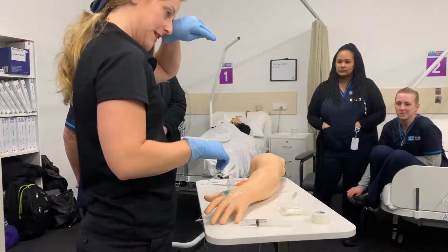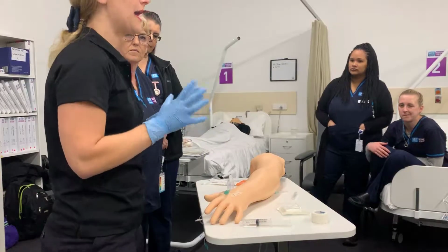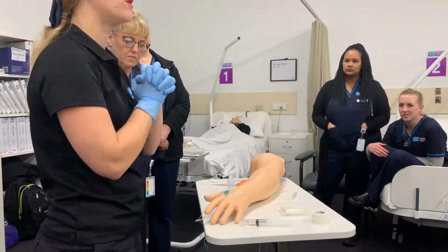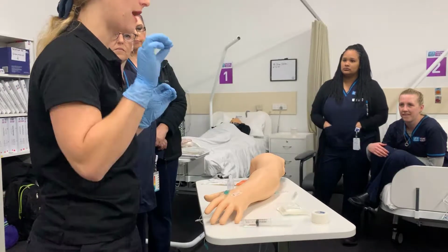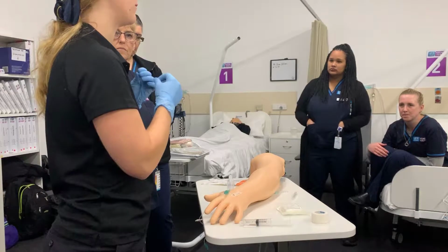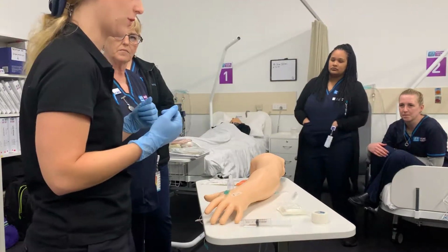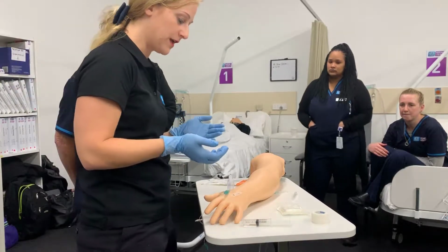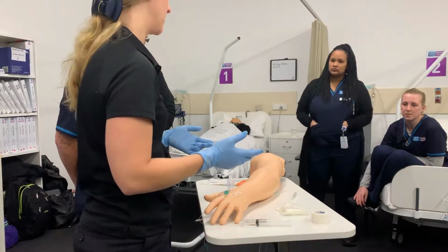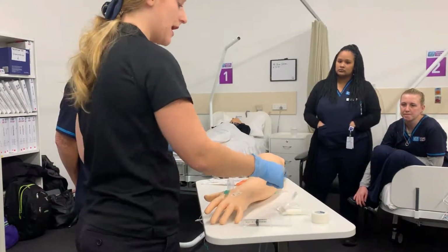Okay, so I'm going to show you guys how to remove an IV cannula. So again, ENs are allowed to remove cannulas. Basically, your only two restrictions are you cannot insert them and you cannot put fluid through a CVAD, a central venous access device, okay? All right, so to remove a cannula, it's very, very similar to changing the dressing, the tegaderm, except that the cannula is coming out.